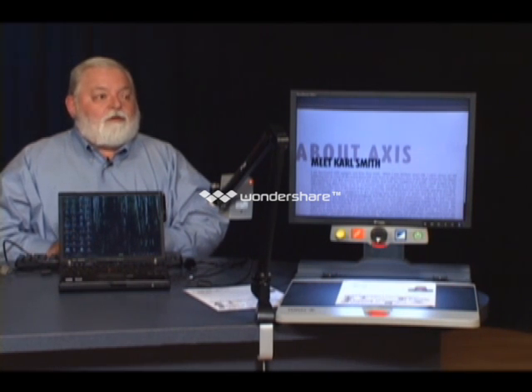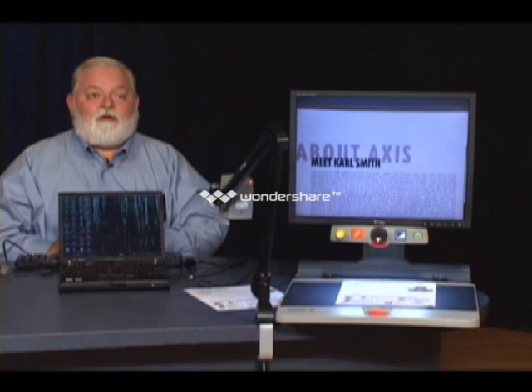Now, the other thing that you can see on this one is, well, actually all the new machines now that are like this have what's called automatic focus. So whatever we put under here will stay in focus. And if you put a big fat book under here or this one thin brochure under here, it'll be focused.